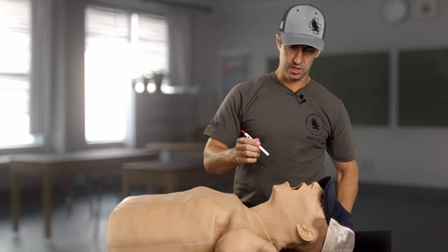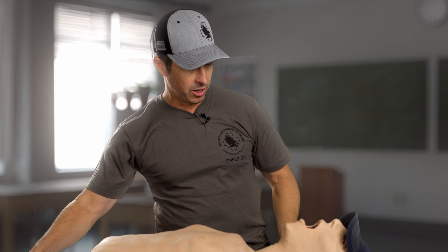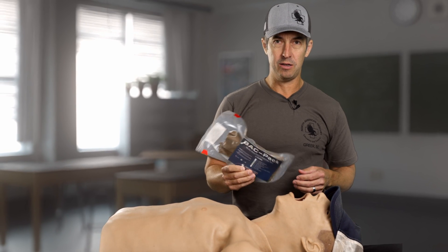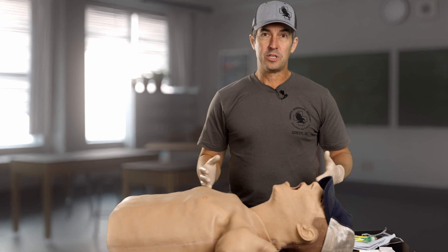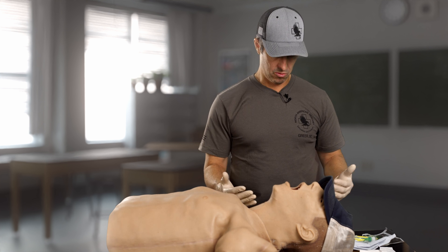How do you do a cricothyroidotomy? Doc Miles here at North American Rescue. First thing — take your ballpoint pen, remove the contents, and make a sharp stabbing motion in the patient's throat. Just kidding — never do that. What we are going to do is use a dedicated cricothyroidotomy kit called the Backpack, a bougie-aided cricothyroidotomy pack from North American Rescue. The first thing I'm going to do is open up the kit contents, get them laid out and tested in the right order.